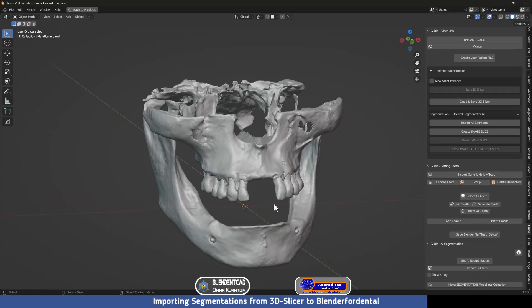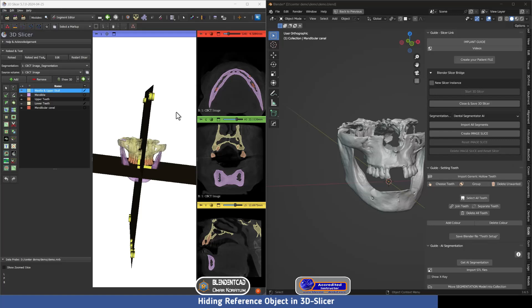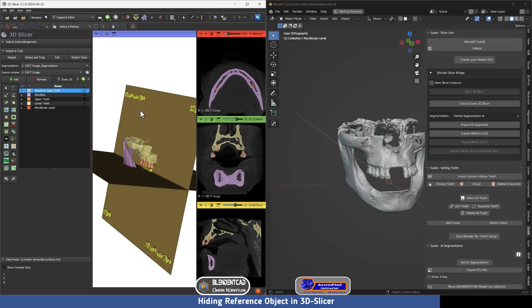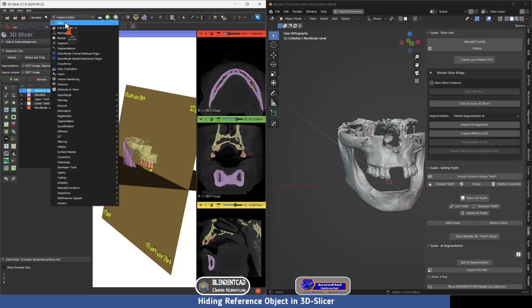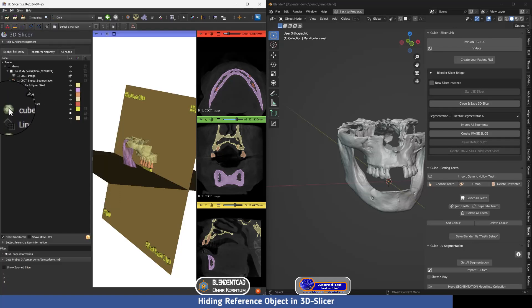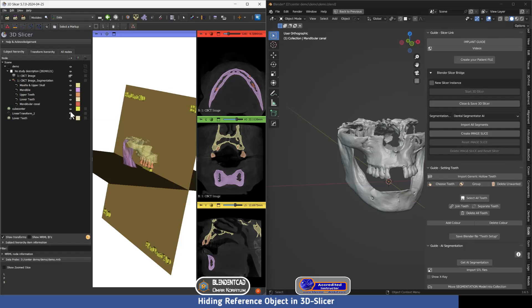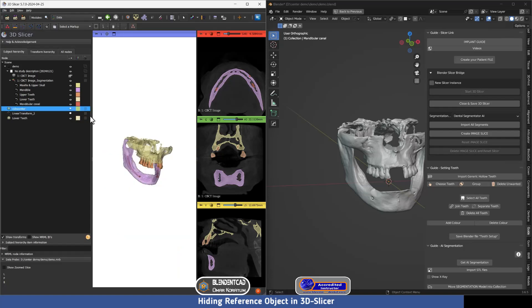Blender has finished importing the segmentation from 3D Slicer, and as you can see the segmentation has been placed at the center of Blender for Dental. We are going to split the screen — half with Blender for Dental and half with 3D Slicer — to continue implant planning. The object we used for alignment is still visible; to hide it, go to the dropdown menu, press Data, look for the model icon, and find the file named 'cube center' — just press the eye icon to make it disappear.